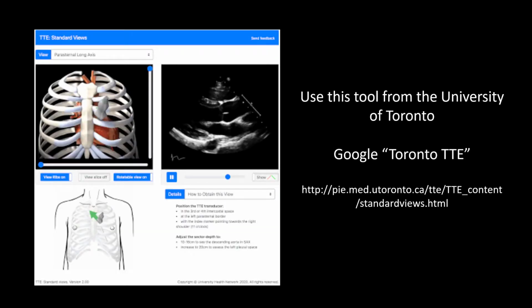I would like to encourage any learner to refer to the wonderful online app created by the University of Toronto. It is an interactive way to go through basic and more advanced cardiac echo views. You can find it by Googling Toronto TTE or following the link shown on this slide.